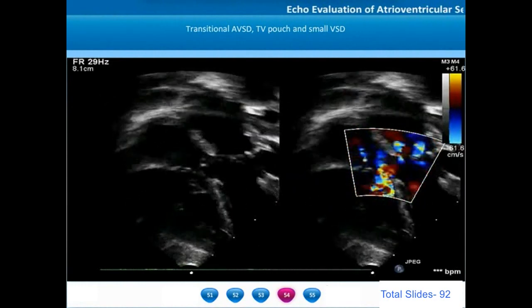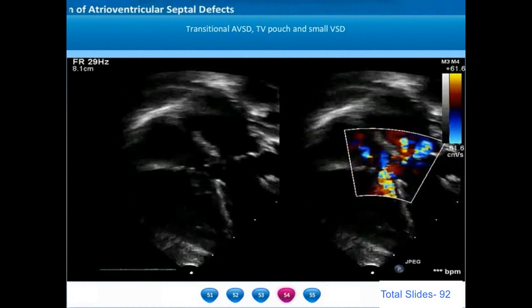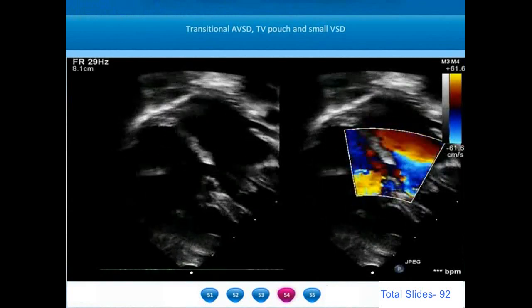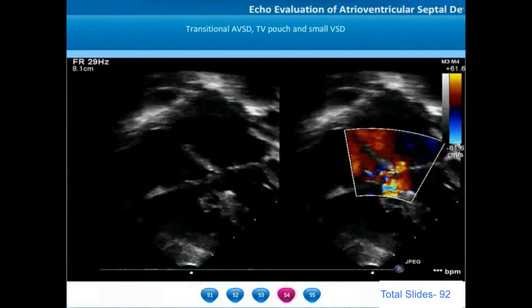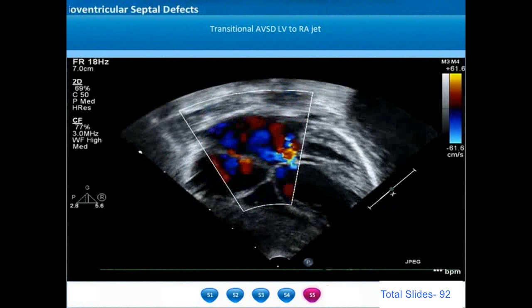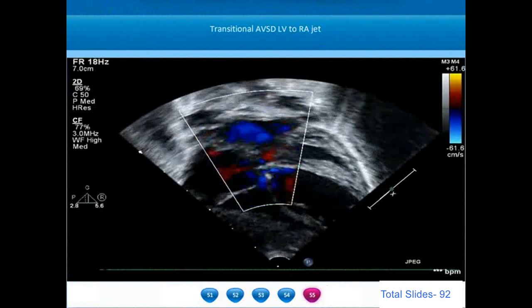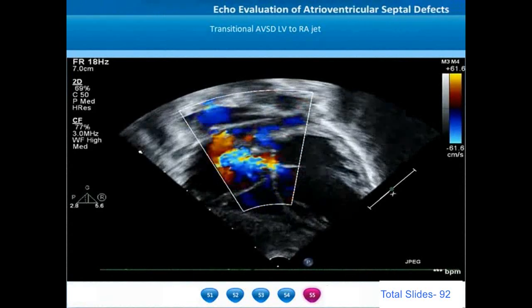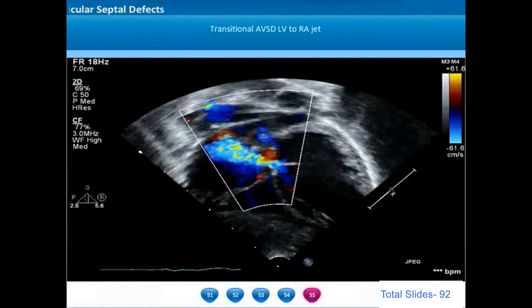In this example of transitional AV septal defect, the bridging leaflet cordae are not completely attached to the crest of the interventricular septum. There is a tricuspid valve pouch, but through it there is color flow from the left ventricle into the right ventricle, indicating a restrictive inlet VSD. In a transitional AV septal defect there can also be jets directly from the left ventricle towards the right atrium due to a regurgitant orifice from the bridging leaflet through the primum ASD into the right atrium, representing AV valve regurgitation from left ventricle to right atrium.